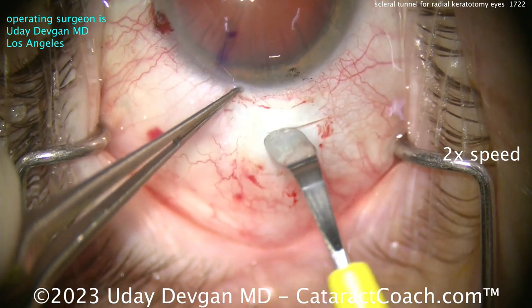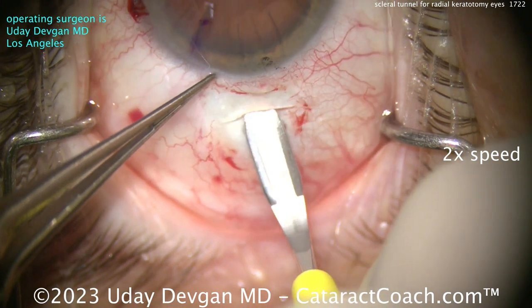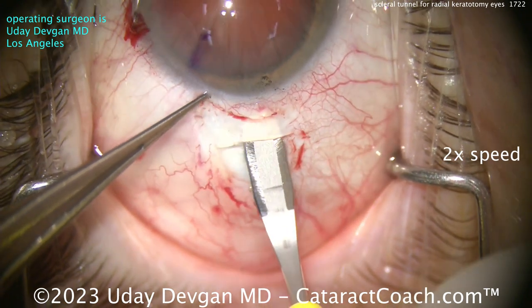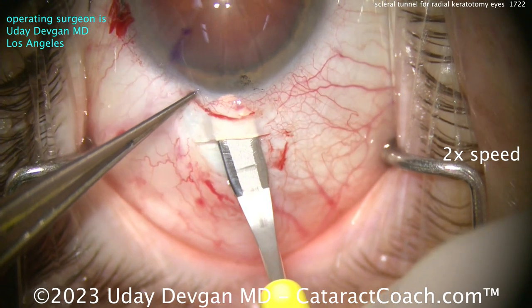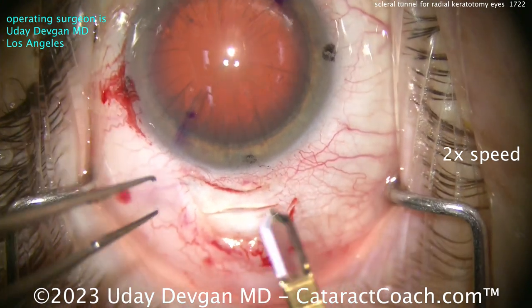The scleral tunnel is a half scleral depth groove right here, and using that crescent blade to stay within that groove — half scleral depth is our goal. Advance it, and notice the angle of the crescent blade is angled upwards from that incision at the limbus toward the root of the cornea. I want to just barely get the tip of that instrument into the clear cornea so we can see it.